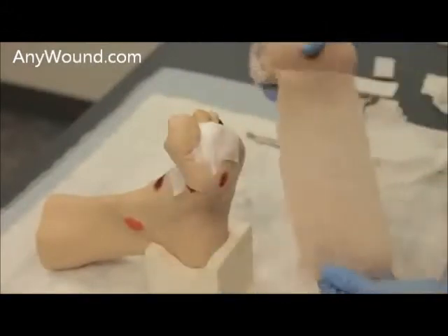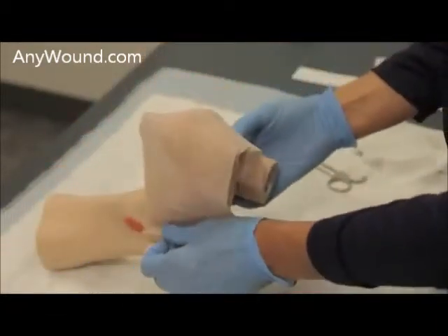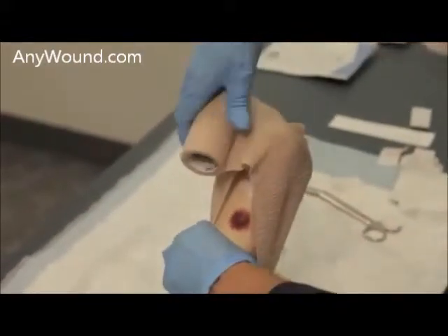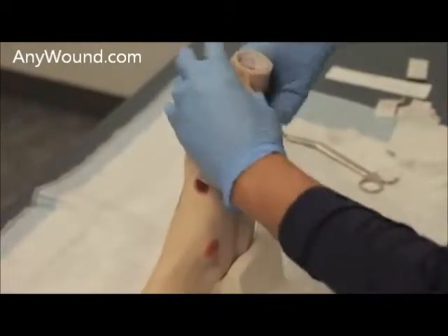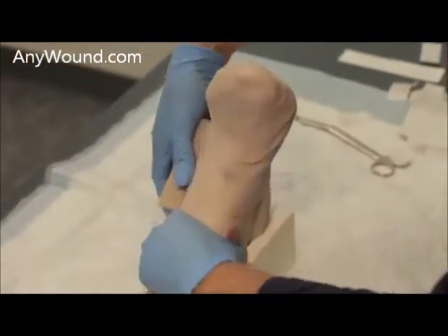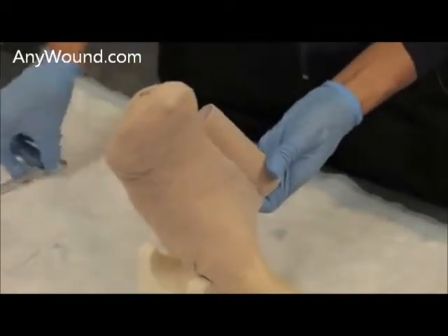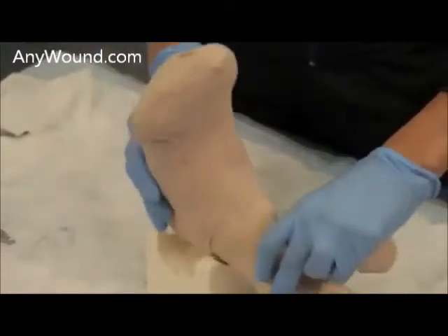And there you go. Now, further securing is necessary if the patient is ambulatory — an additional coban can be utilized to cover the whole area, as with any toe band. Curlix is another option for securing a dressing on a patient that may not prefer the coban due to its sticky nature. Either way, it will still be tightly secured, either with coban or Curlix, based on patient preference. Some patients may just prefer to have tape; if they're non-ambulatory, tape is sufficient in most cases.